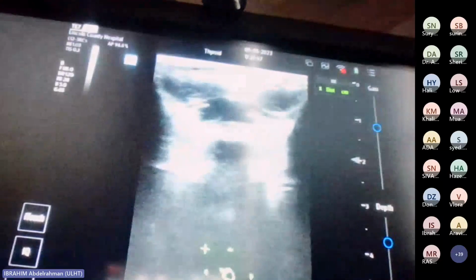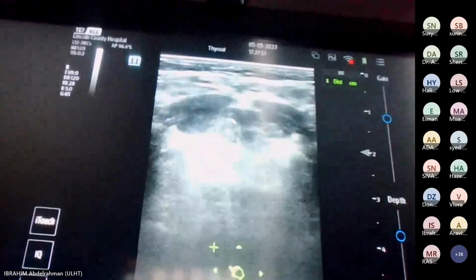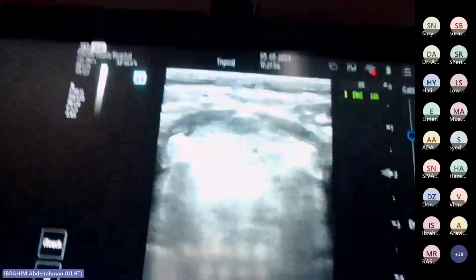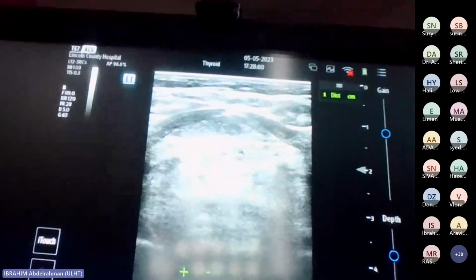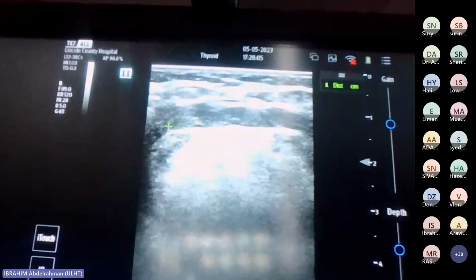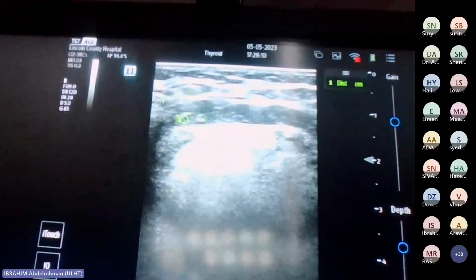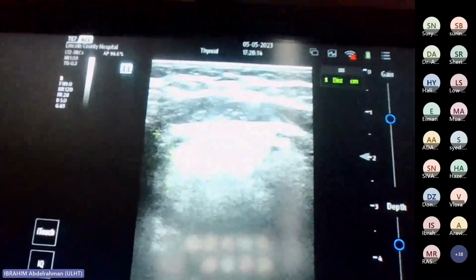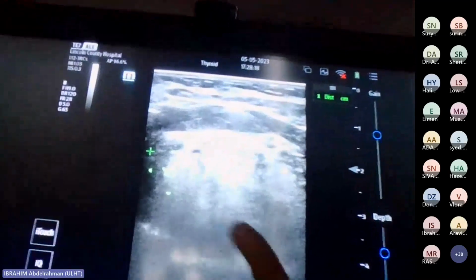Basically the chin all the way down to the hyoid bone. So if you just wiggle your tongue for me, we can see the tongue here. So if there was a base of tongue lesion, you might be able to see it on ultrasound. And here's the back of the genioglossus, and we can come down a little bit further, and we also catch here the hyoglossus muscle. So this is the mylohyoid muscle, this is the hyoglossus muscle. This is an intrinsic tongue muscle, so this one will move with the tongue. So just wiggle your tongue again. Yeah, so you can see that.